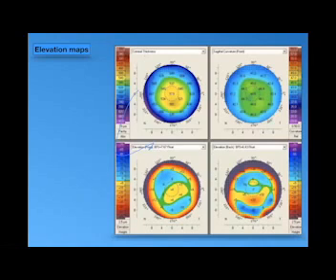Regular cornea, symmetrical cornea, regular and symmetrical, but the steepest K is how much? Say 49. And all the figures in the maps are okay, and we assume the corneal biomechanical properties are okay, the patient's age is okay, and the refraction is a high degree of myopic astigmatism, right?